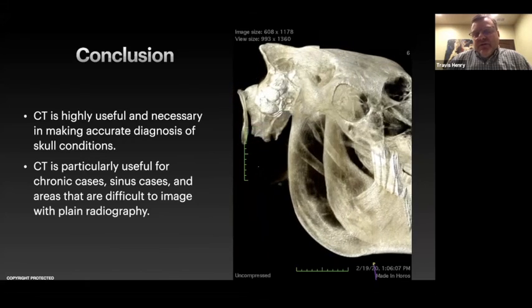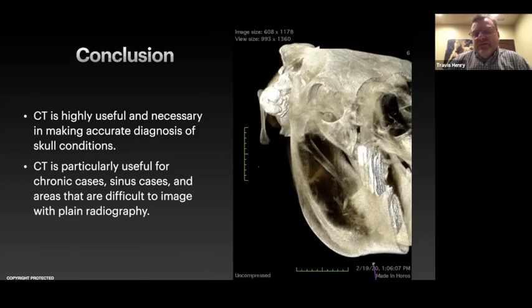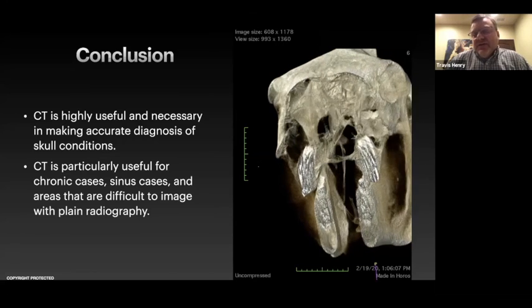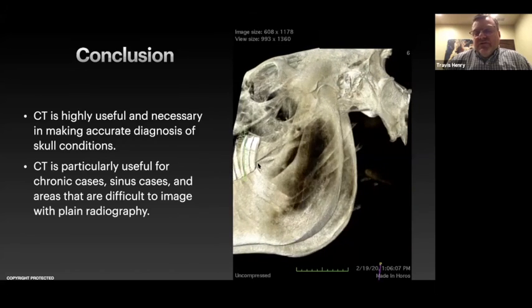I mean, I had the opportunity to be in Europe several different times in the past 15 years, and they've had standing CT much longer than we have here. And I actually helped put together the first standing CT in Texas that was in this country many years ago, and saw the need for it then.